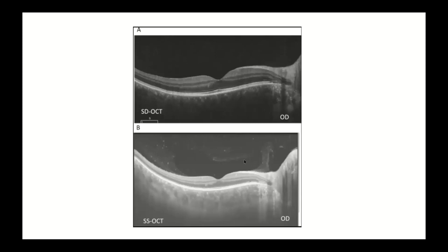Not only can swept source OCT capture the image in front of the retina, but it also provides information behind the RPE cells — you can see a faint line representing the choroid. In Malaysia, Japan, and parts of Southeast Asia, polypoidal choroidal vasculopathy (PCV) is a prevalent disease, and a lot of research has gone into studying the choroid. This thickened choroid, called pachychoroid, can be associated with conditions such as PCV.